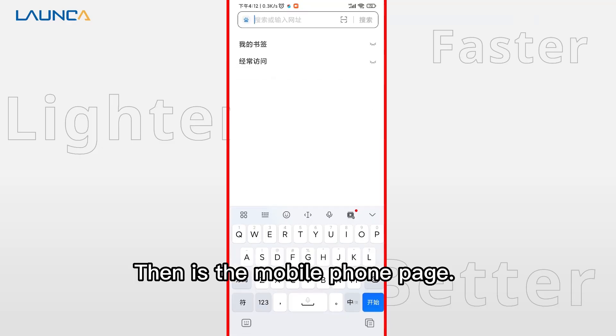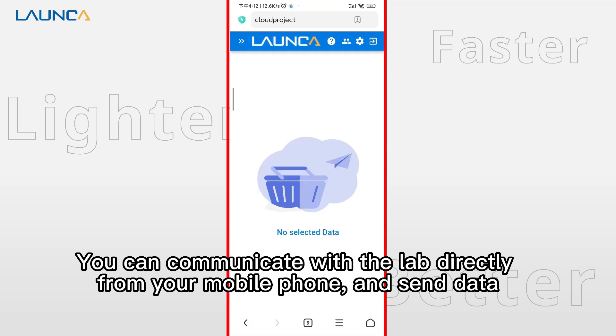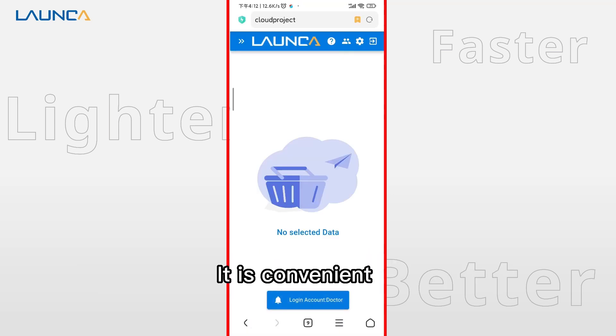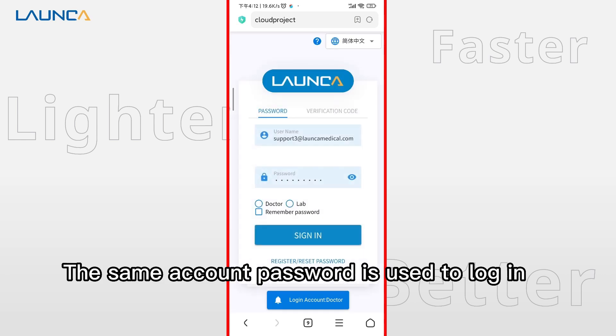Then is the mobile phone page. You can communicate with the lab directly from your mobile phone and send data. It is convenient. The mobile page is more concise. The same account password is used to log in.